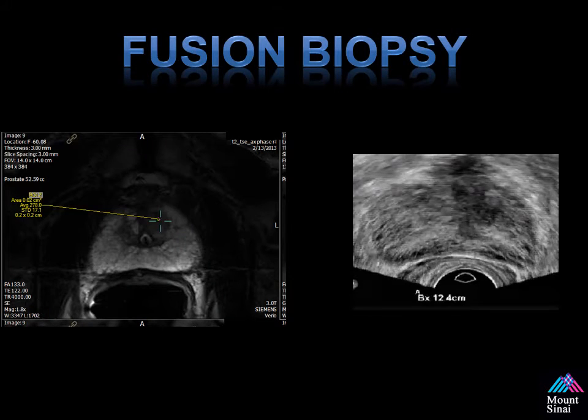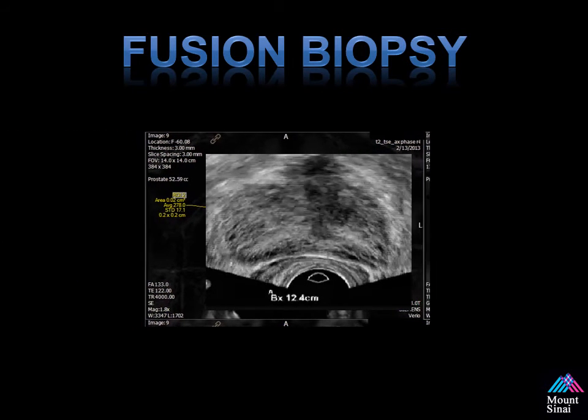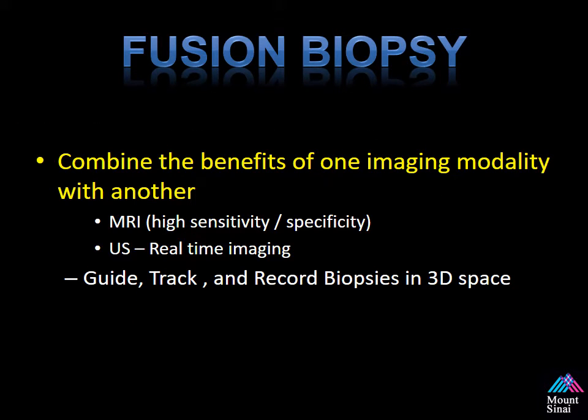What is Fusion? In its simplest terms, it's the ability to combine two data sets together — the ultrasound seen on the right and the MRI on the left — and overlay these in 3D space. We use the benefits of the MRI with its high sensitivity and specificity for detecting prostate cancer, and the ultrasound for its easy use and ability to do real-time imaging. It allows us to guide, track, and record biopsies in 3D space.